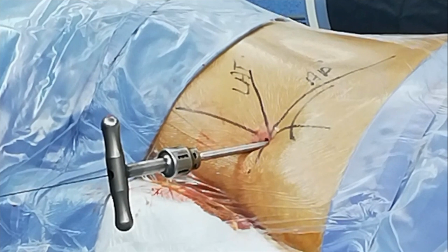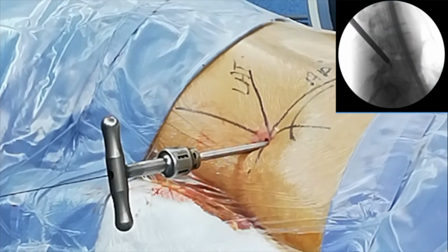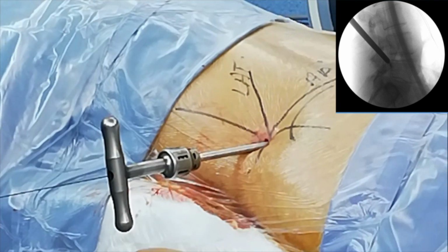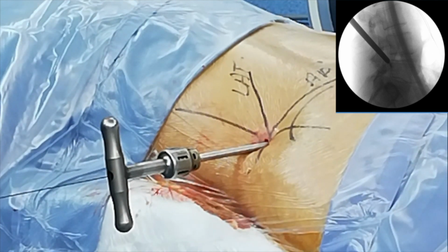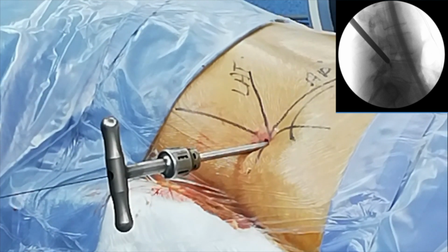X-ray again. Okay, and that's where we want to be. So we are reaming away from the exiting nerve root, plenty of space for the nerve root, and reaming is only into the base and the ventral part of that SAP. So back to AP, please.